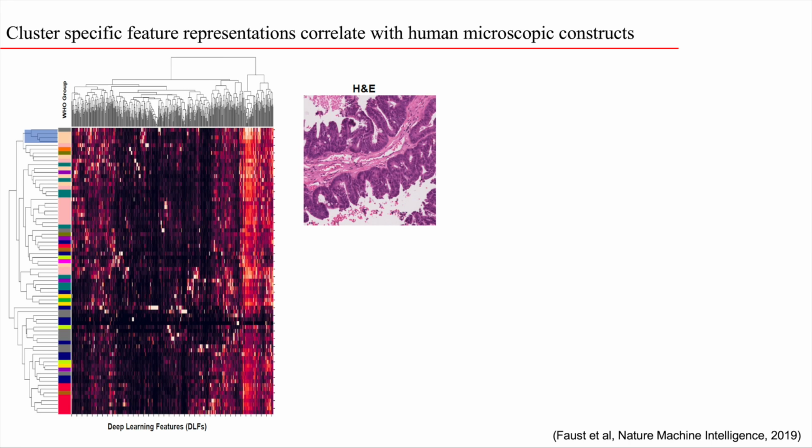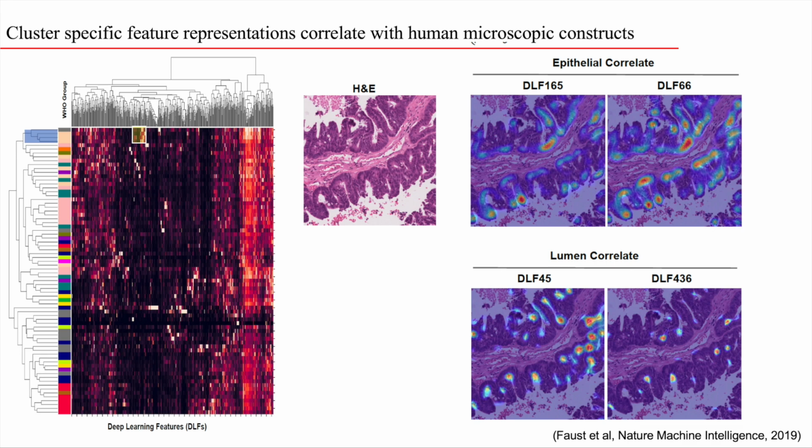Now, the nice thing about grouping these tumors together is that we can find these specific nodes in the neural network that are common. So you can see here, this particular feature or node in the neural network lights up whenever a metastasis is noted. It's a metastasis group. So we can actually use that node to kind of colorize on this image where of the map it's most activated on.